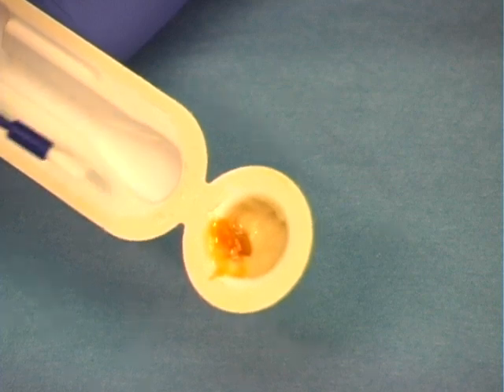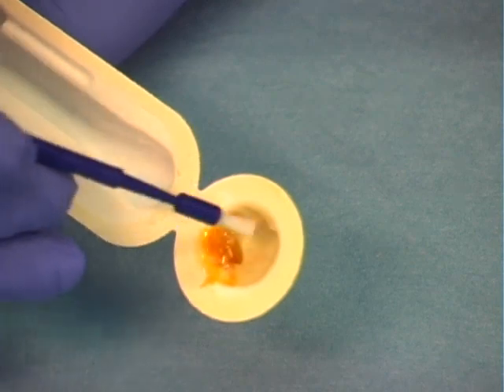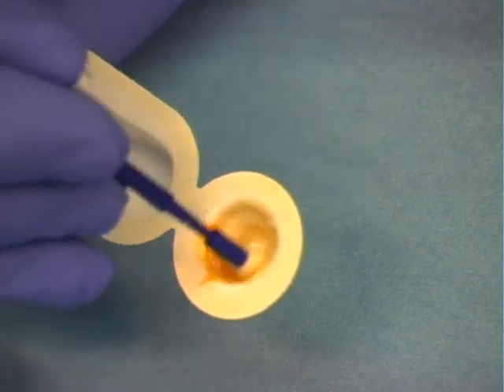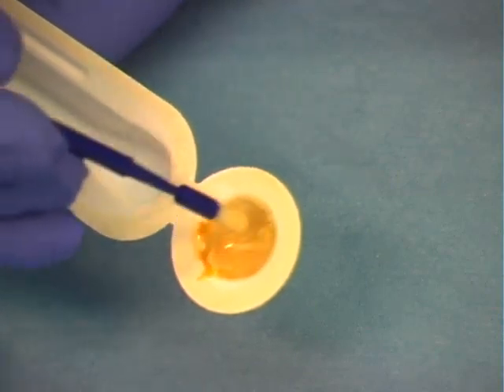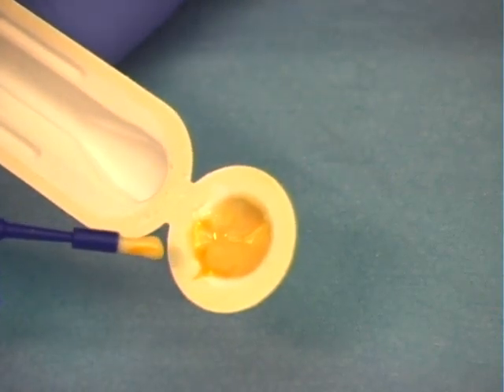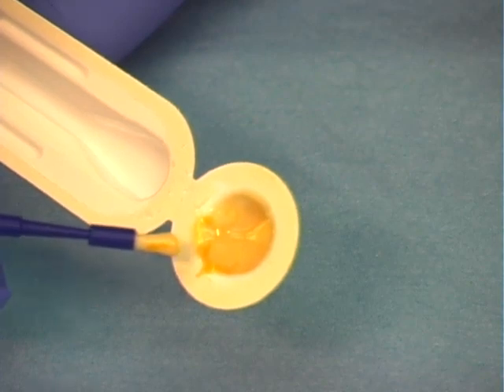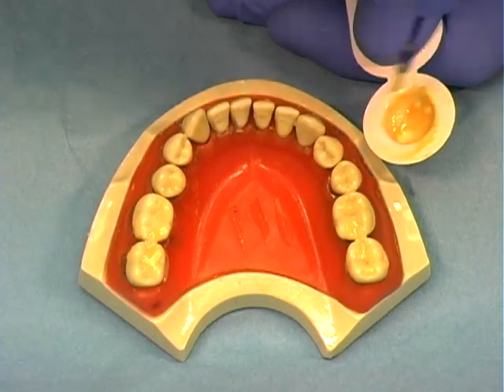Dispense the varnish from the packet using an applicator brush. The applicator brush should be dipped into the varnish and mixed well to get a homogenous mixture. Varnish sets up in the presence of saliva, but it is recommended to remove excess saliva by spraying air quickly on the teeth. Systematically paint a thin layer on all tooth surfaces.